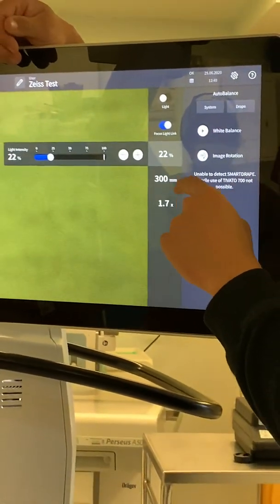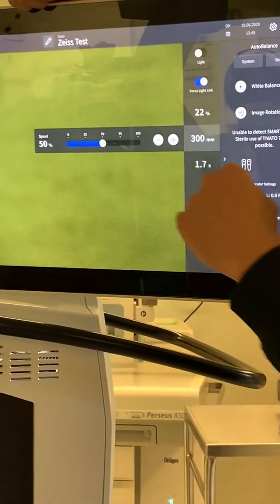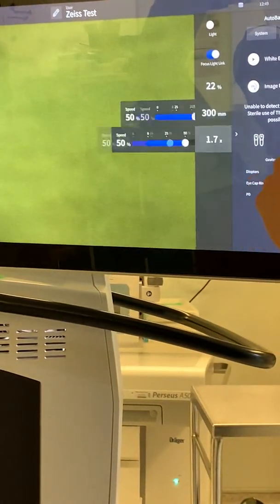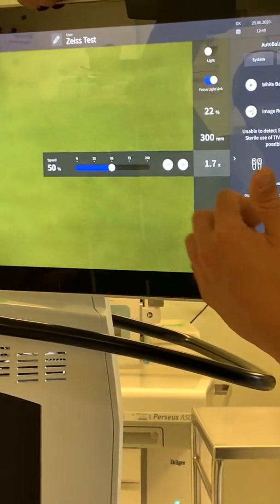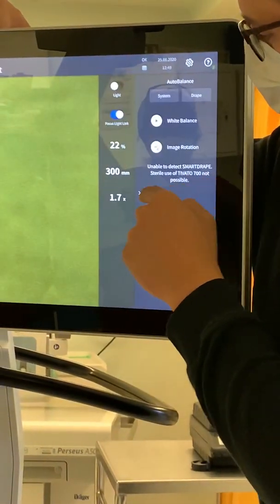Here we have the focal distance — the distance we're actually viewing at. The only thing we can control here is the speed at which the zoom or focus changes. The same applies to your zoom: we can't change the focus or zoom directly, we can only change the rate of change.